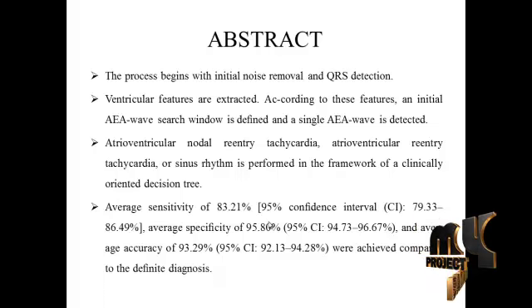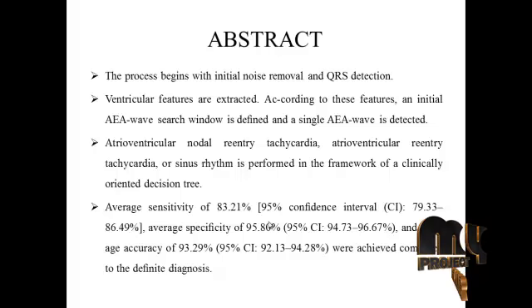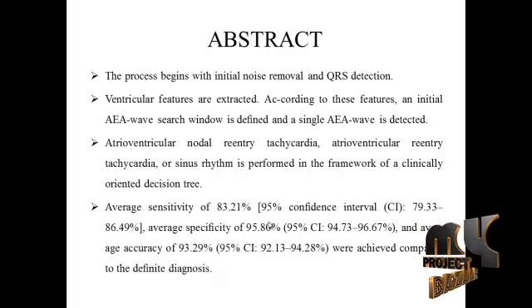An average sensitivity of 83.21%, average specificity of 95.80%, and average accuracy of 93.29% were achieved compared to the definite diagnosis.